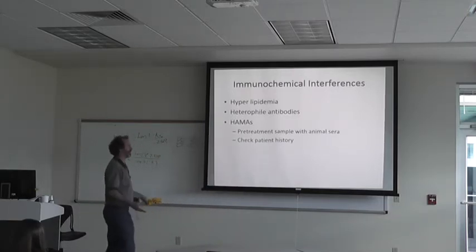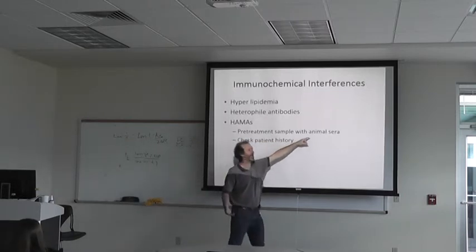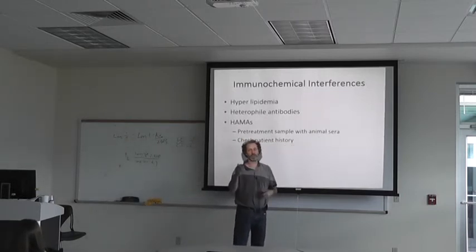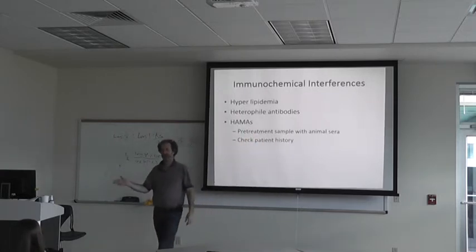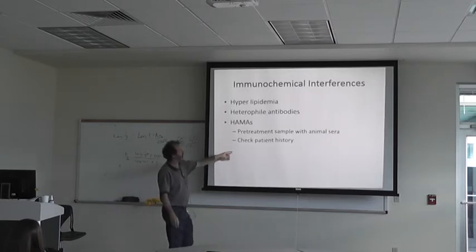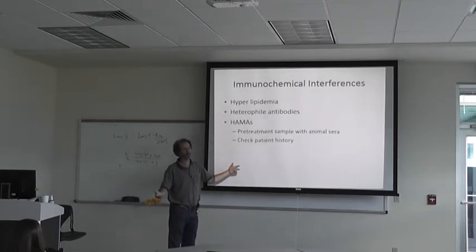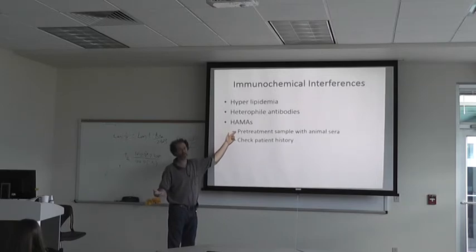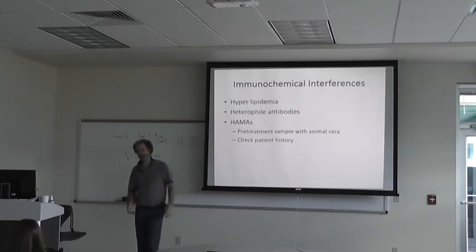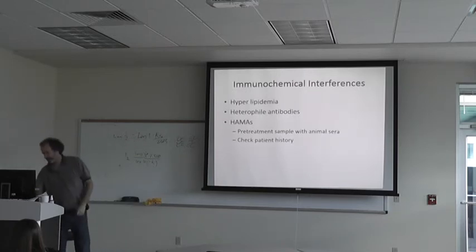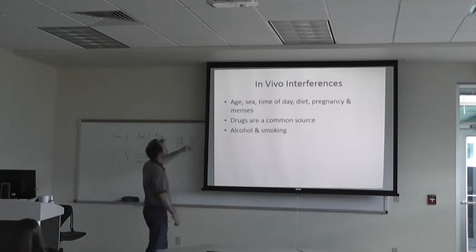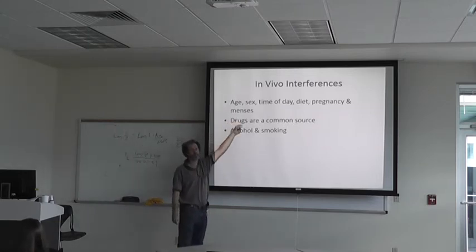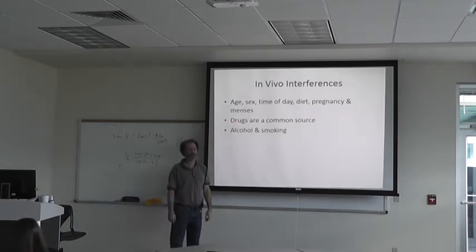If you pre-treat the sample with mouse serum, hopefully you'll tie up all the anti-mouse antibodies with that serum and saturate them. You also want to check the patient history to see if they've been treated with mouse antibodies or other types of antibodies that might interfere. And then there are in vivo interferences such as age, sex, time of day, diet, pregnancy, and menses — we already talked about that in chapter 18.